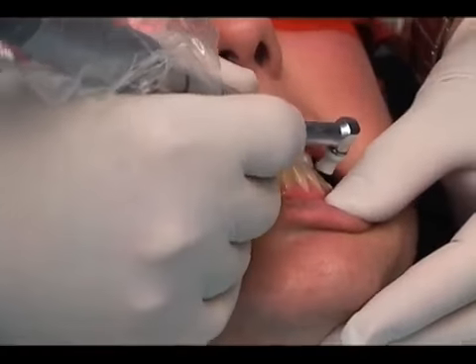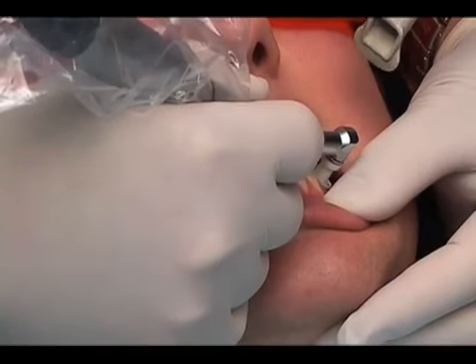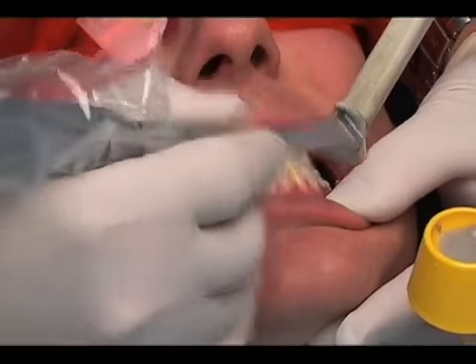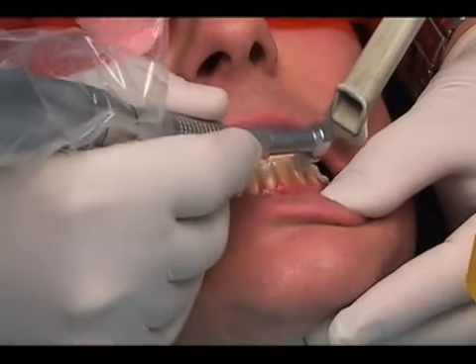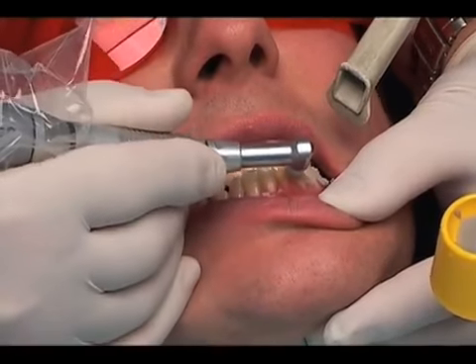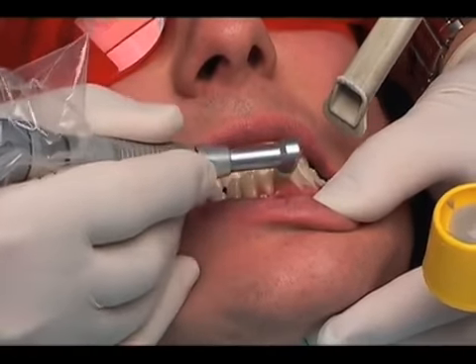Clean the teeth with a Prophy cup using a flour-based pumice that is free of glycerine and fluoride. Your goal is to remove plaque and debris from the teeth to allow the whitening material to stay in close contact with the tooth. Thoroughly rinse the teeth to remove all the pumice.